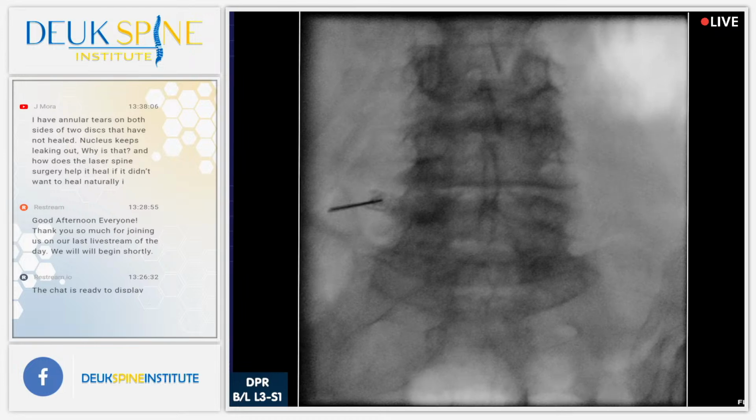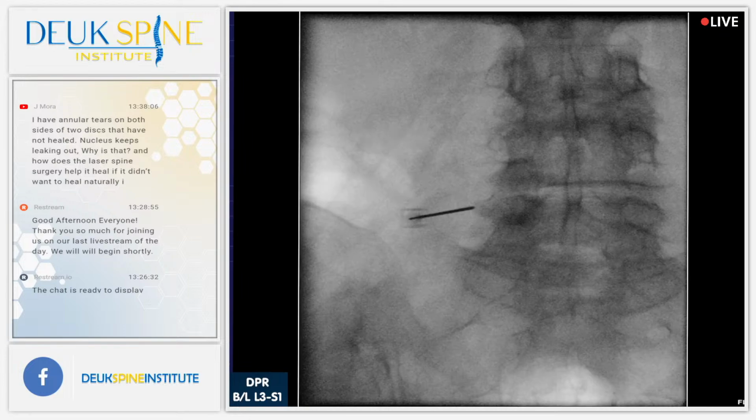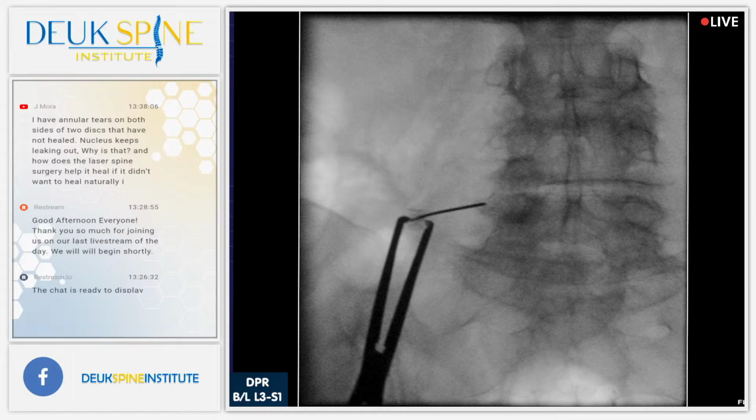Come to me a little bit. You're too far to you. All right. Yeah, I see it. Show us the target. That's correct. Maybe a little bit medial to that, but that's pretty darn good. Shot? Yep. There? Hold on, let me just feel the bone. Yep, we're there. Let me have the coker. All right, shot. That's pretty much perfect right there.